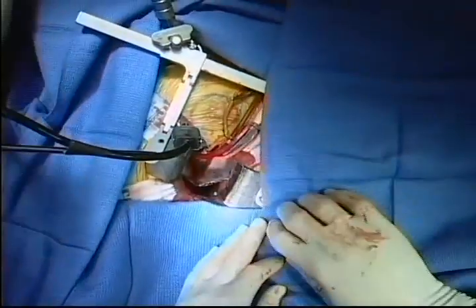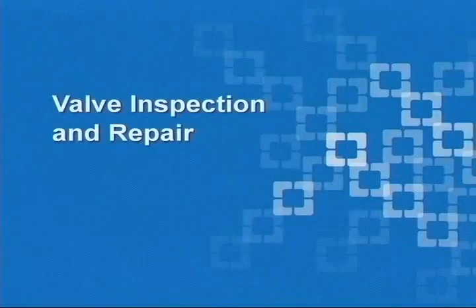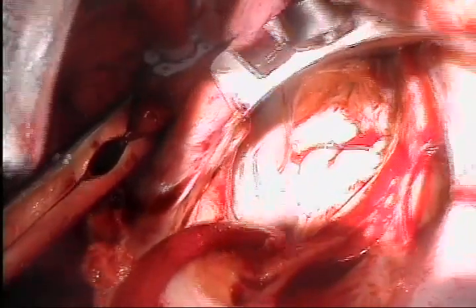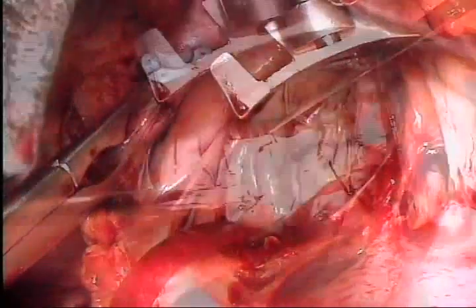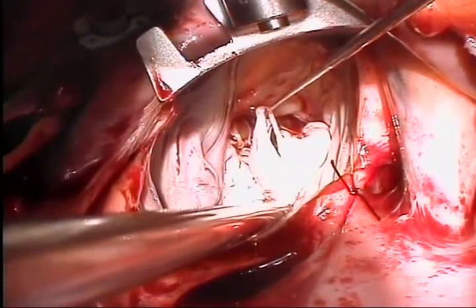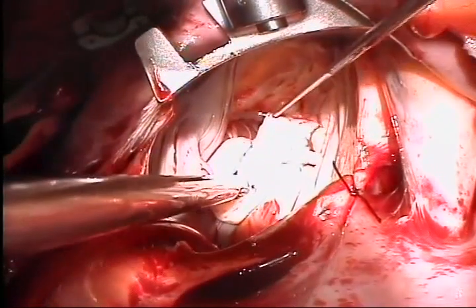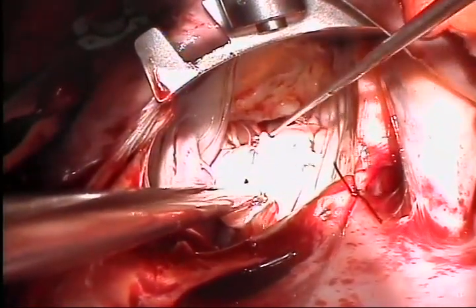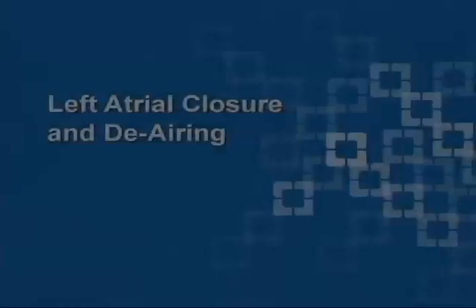Attention then focuses on mitral valve examination and repair. Through this incision, exposure of the valve is excellent. The anterior leaflet, posterior leaflet, and subvalvular apparatus are all visible. The site of pathology is clearly evident with elongated cords in the middle scallop of the posterior leaflet. Other posterior leaflet cords are normal. The anterior leaflet is also inspected, and in this case is normal.